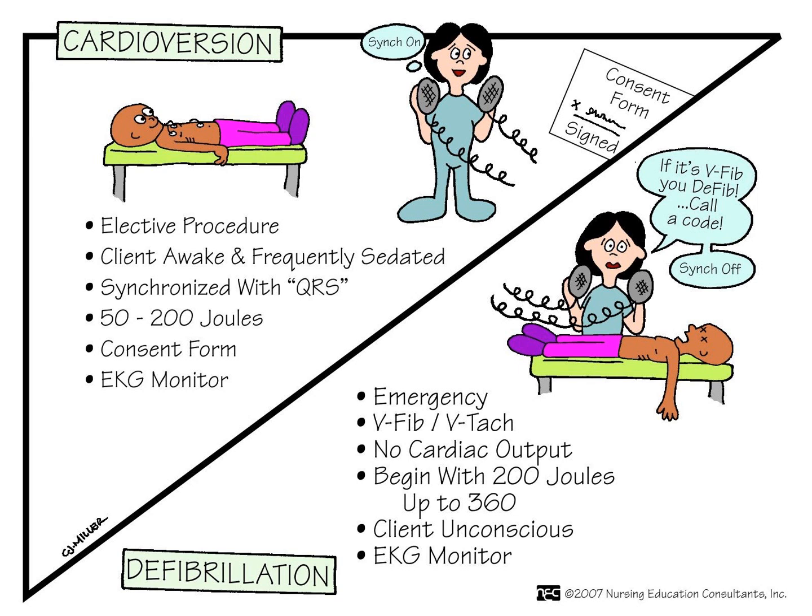And then they could also use it for other dysrhythmias that we really haven't talked about, but there's one called supraventricular tachycardia, and they may select 50 joules for that. So they can select different amounts of energy to attempt to cardiovert these rhythms. But certain rhythms, like we've discussed, are very sensitive to cardioversion, and low energy levels are likely to bring about the conversion. Okay. Truly AFib and VFib would require higher energy levels. Okay.